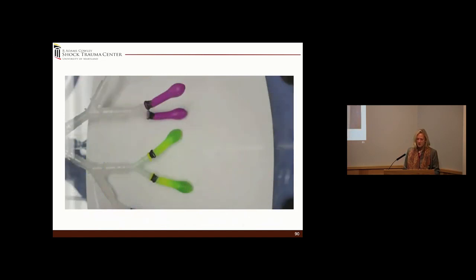We had some respiratory therapists who were challenged with a project that they had to do, and they took this study and redid it. They created a bronchial tree with little balloons, and they filled each balloon with guar gum. So they created this mucus. Then what you're going to see is a time-lapse video. We sped it up, but for the exact same amount of time, comparing pressure control with APRV. Pressure control 1-to-1 with TCAV, okay?